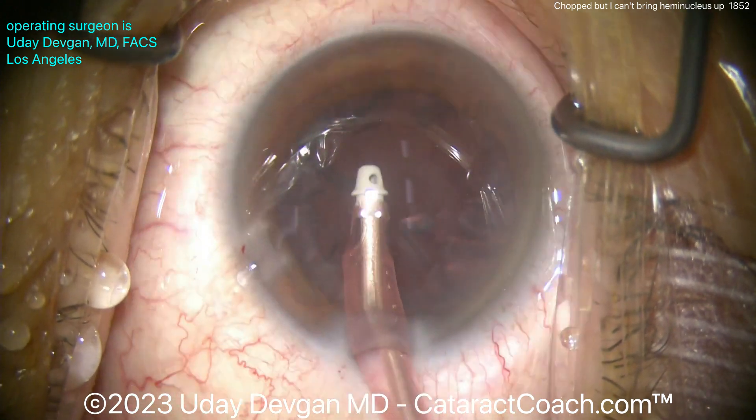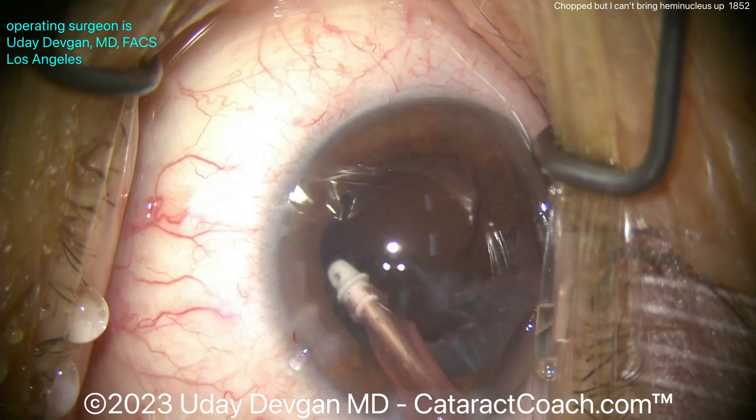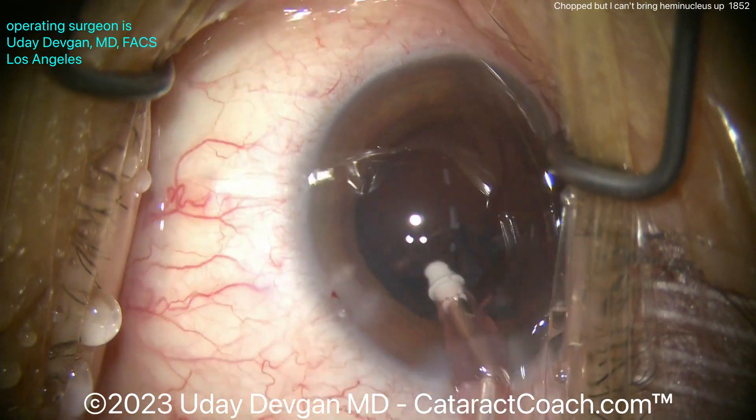Nothing else out of the ordinary — we'll clean up the cortex here, and I'll show you at the very end that the rhexis is a good size. We'll compare it to the IOL optic, which in this case is going to be a six millimeter optic, so it's very easy to judge the rhexis size.